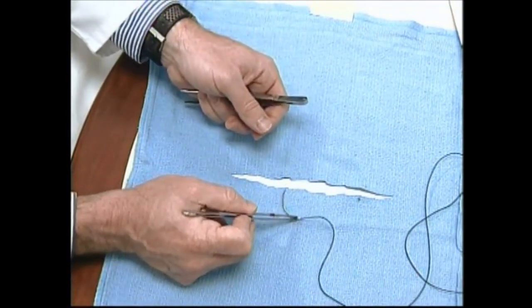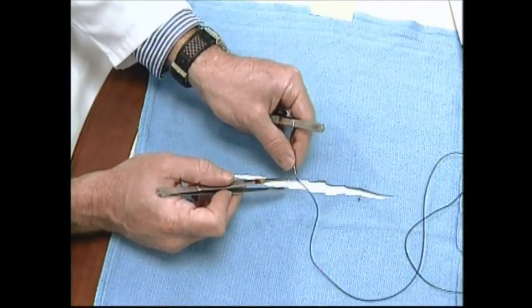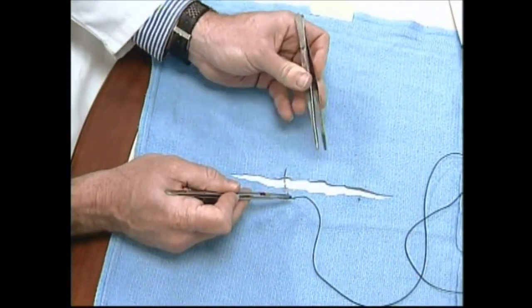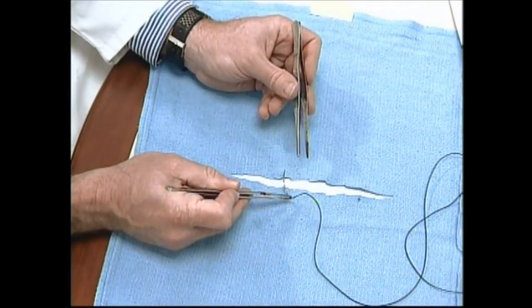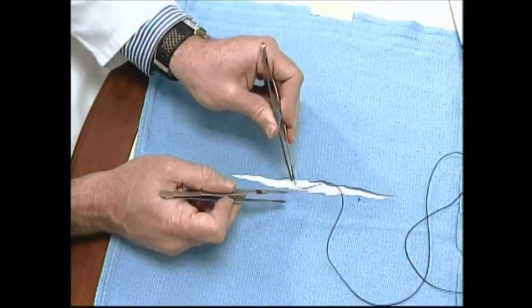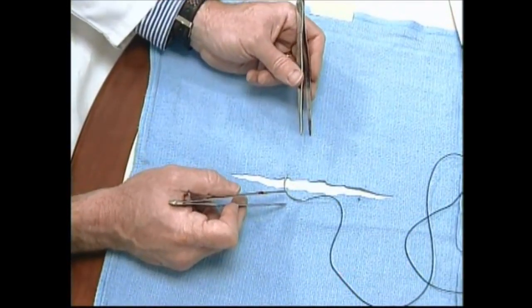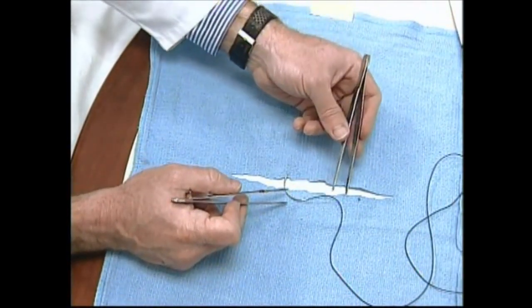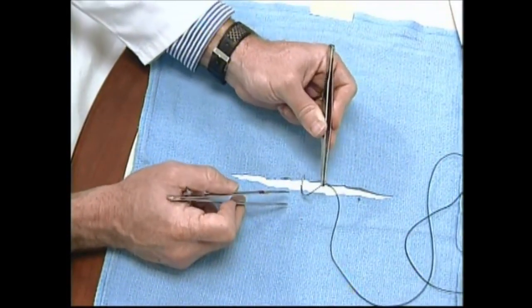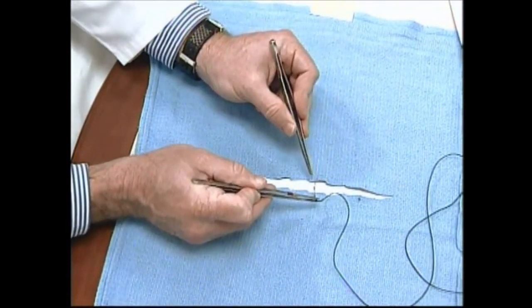Normally when we're putting a needle in the needle holder in the operating room for normal surgery, we pick up the needle or hold it with another instrument. This is almost impossible to do in microsurgery because you can't easily pick up the needle — it's hard to grab and it sometimes flies away. One easy technique is to grab the suture attached to the needle, spin the needle up in the air, and then grasp it about two-thirds of the way down.